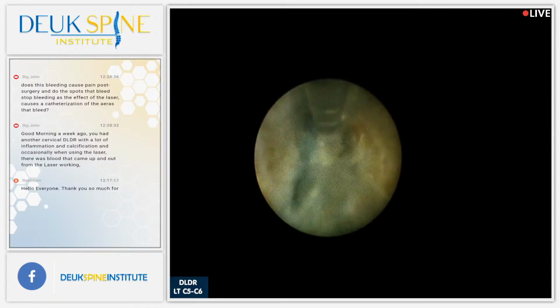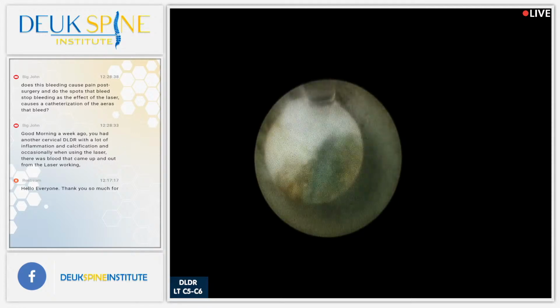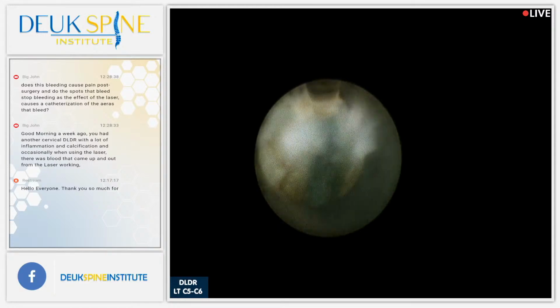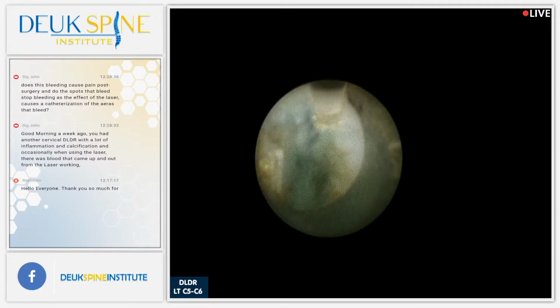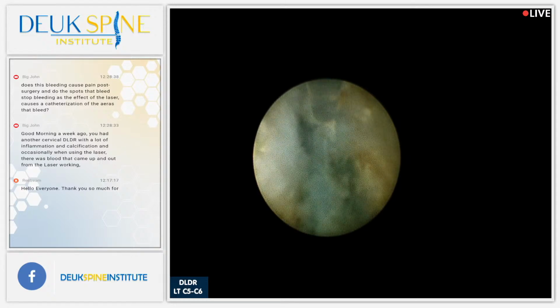Big John, that is a loaded question. Great question, though. So, yes, last week, and anytime we have a patient with a lot of bone spurs, we've got to do some bone spur removal if the bone spurs need to be removed. Not all of them need to be removed, though. I always say that. And, of course, those bone spurs do bleed, but they don't bleed excessively.